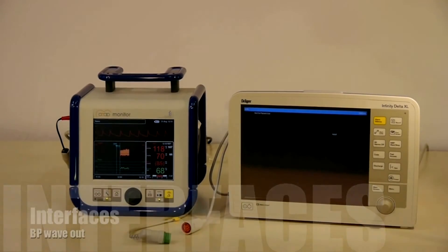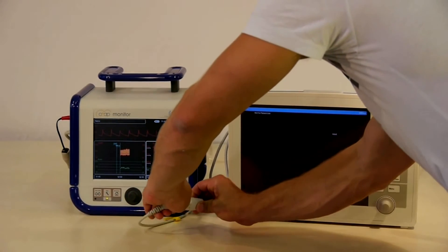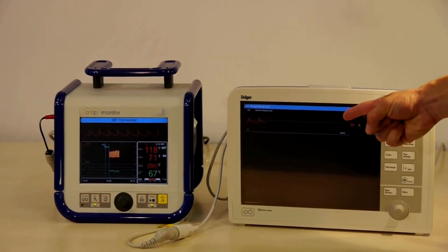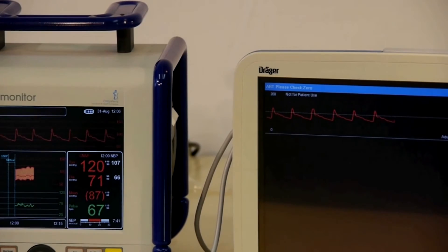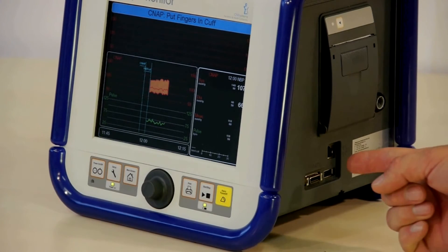CNAP easily interfaces with existing patient monitors. To connect with a patient monitor, use the blood pressure wave out connection and the provided cable. The CNAP blood pressure waveform will now be displayed on the patient monitor. Make sure to zero the patient monitor's pressure input upon establishing the connection.